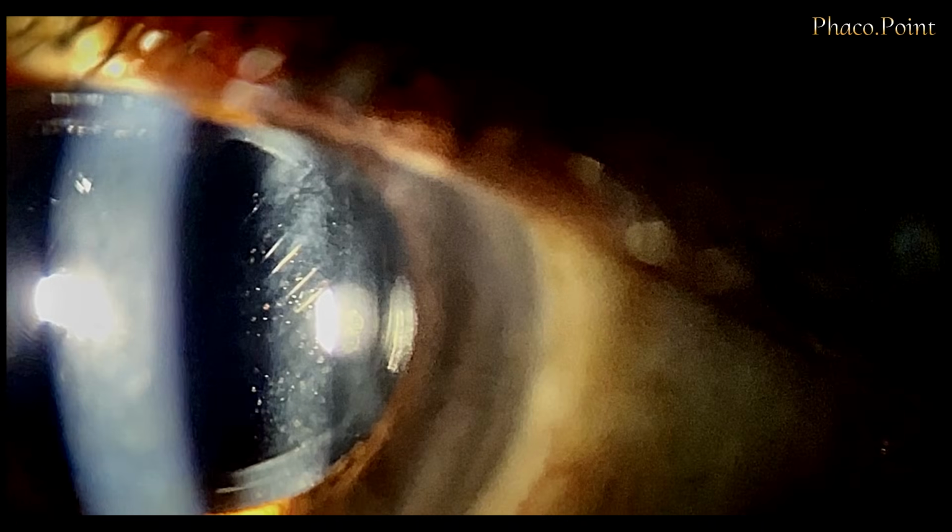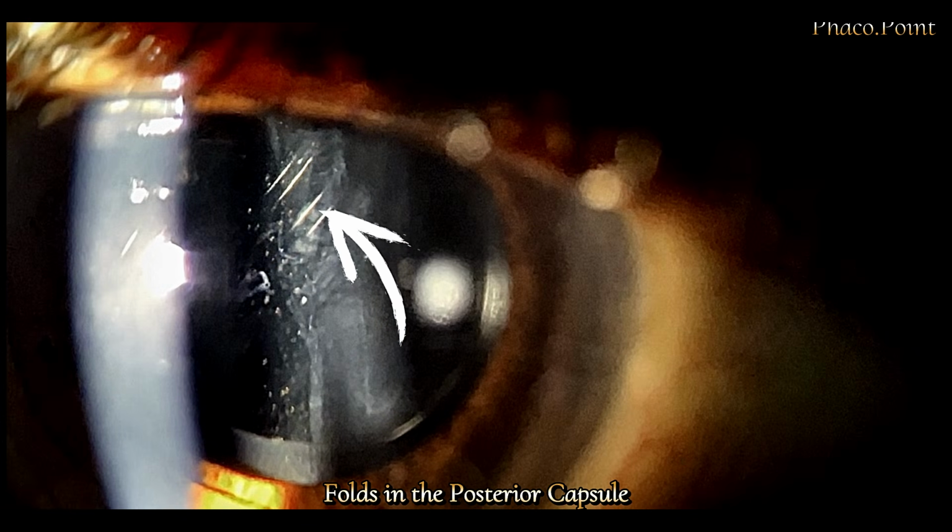This patient, as you can see, presented to us in the postoperative period with folds in the posterior capsule. This patient was extremely dissatisfied with the quality of vision, presented with suboptimal vision, and complained of seeing lines in his visual field as well as distortion of lights when he looked at headlights.